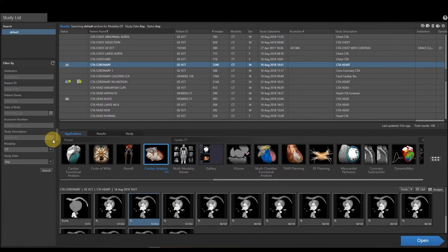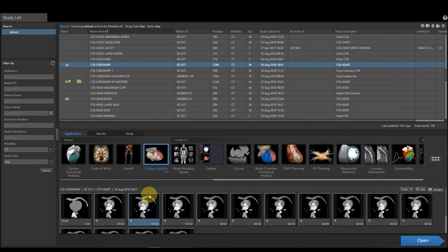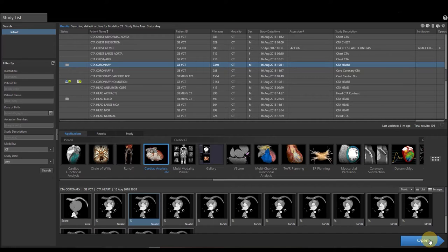My first step is to select my patient, come down and select cardiac analysis, select my series I would like to use for measuring, and then at the bottom right I'm going to go ahead and select Open.